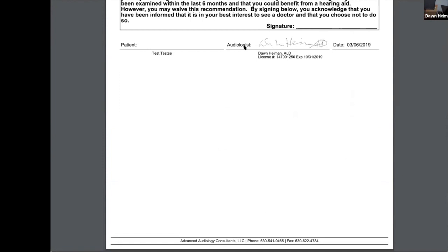I want them to know that this is a long-term process and this is how we're going to work with you. And you guys can make up your own journey where if you don't do demos, you're saying, look, the day of the fitting, this is what's going to happen. The next 3 visits, this is what's going to happen. Here's your homework. This is what you're going to work on. All this stuff keeps going into their folder.